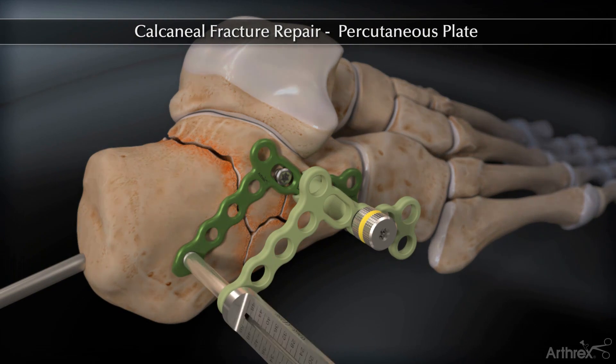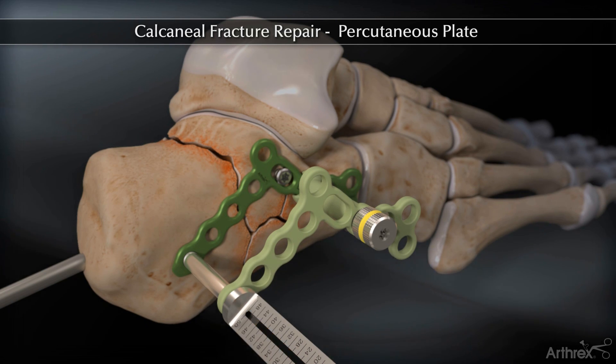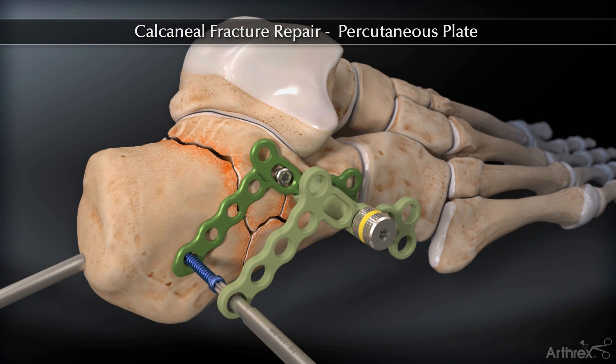Insert the percutaneous locking drill guide and drill. Measure the depth off the laser line. Insert the 3.5 mm locking or non-locking screw.